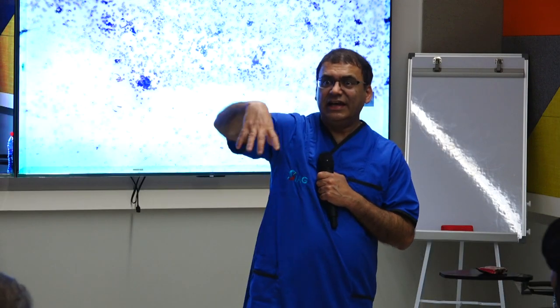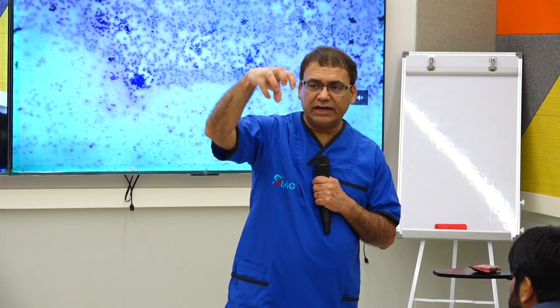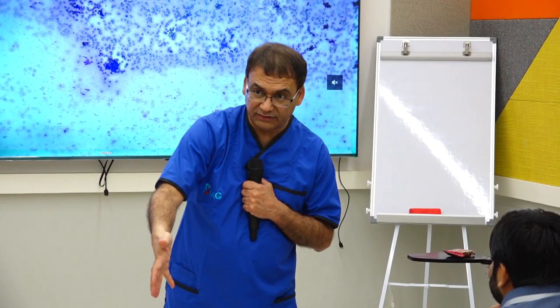The way they do the boring, right? If they keep going in one place, they get all the soil out of it in one go. If you keep going in the same place over and over, nothing is going to come out. So core needle is like a bore needle. Once you go into one area, you may be able to get some more tissue if you go in twice in that same area. But the chances are likely you're just going to get blood in the second one.